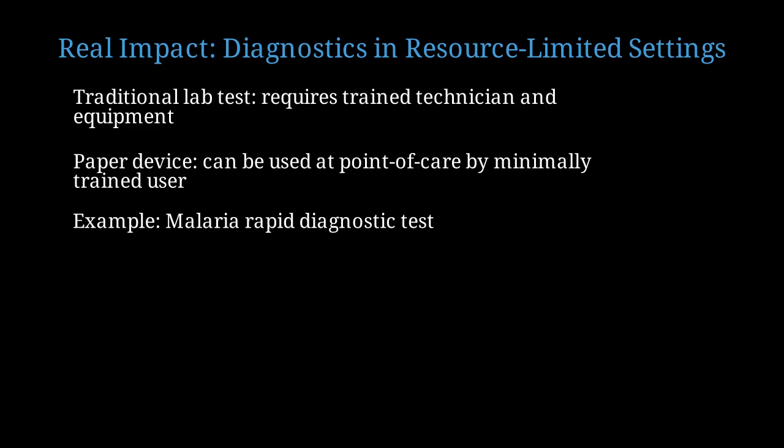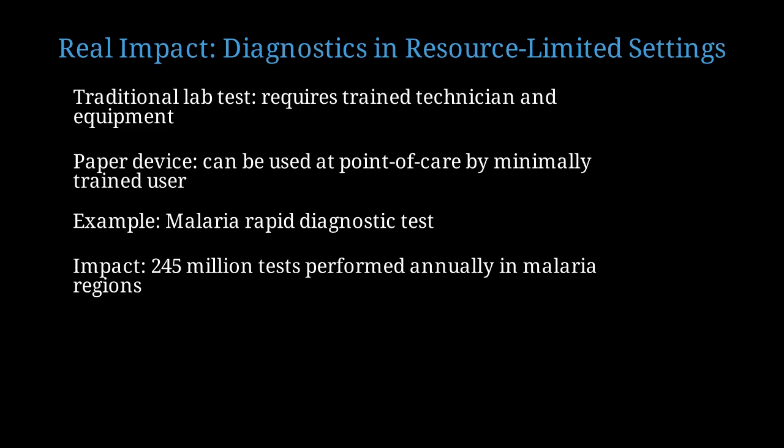It detects parasite proteins in blood within 15 minutes, costs less than 50 cents, and requires no equipment. Over 245 million malaria tests are performed annually using paper-based devices in sub-Saharan Africa and Southeast Asia. This has dramatically improved diagnosis rates.